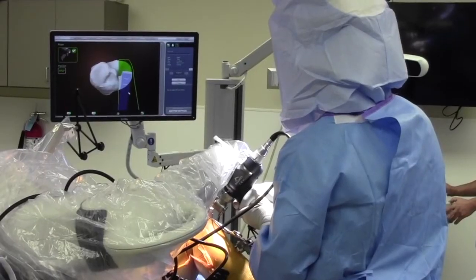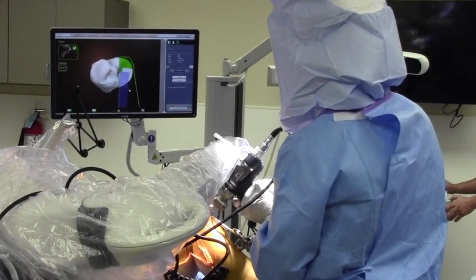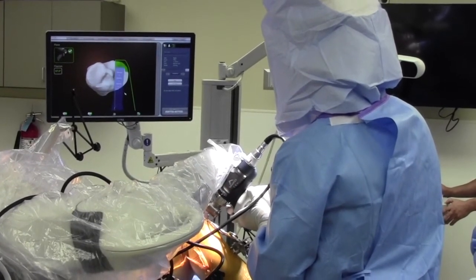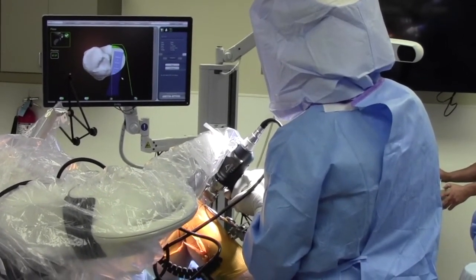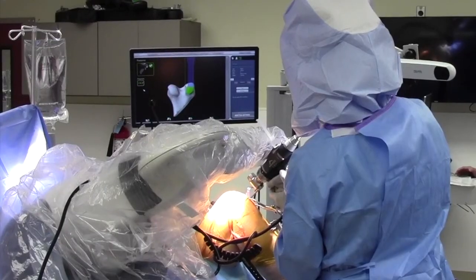We're then going to pass along all of that information to our robotic arm and begin making precise and minimally invasive cuts to remove the focal arthritis of the knee.